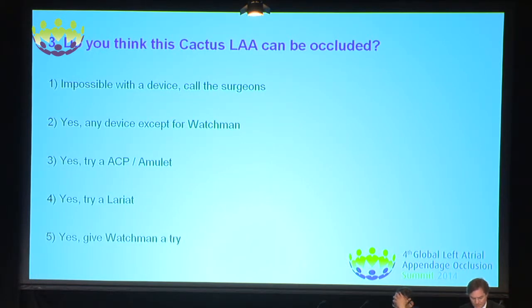Impossible with a device? Call the surgeons. Yes. Any device except for Watchman? Yes, try an ACP or an Amulet device. Yes, try a Lariat. Yes, give Watchman a try.